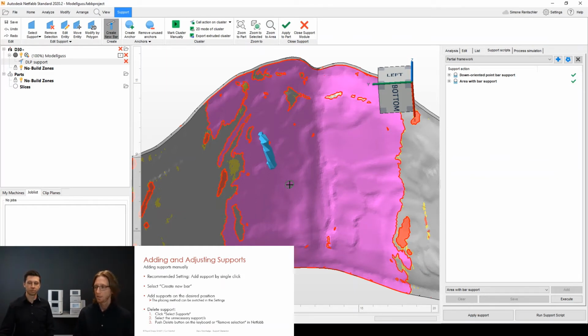What you can see is if you do this a little bit slower, it is just creating a support between two anchors, but as you can see on the picture, this is pointless because you are just creating a support on the surface of the part, but this is not connected to the platform. So what we have to do here is we have to go to the settings, but let me delete this first.